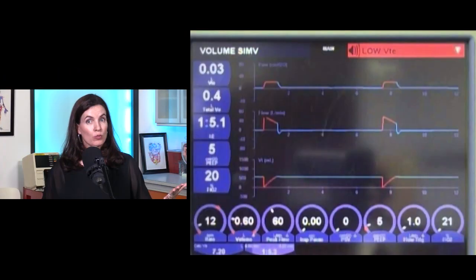Right. So step three is you're reading what is red and flashing. This brings us to step four. Step four is the critical moment here, where you still don't know what that alarm means, but you are now standing in the room with your patient, and you are a smart, educated healthcare provider who can probably do some easy stuff at the bedside.